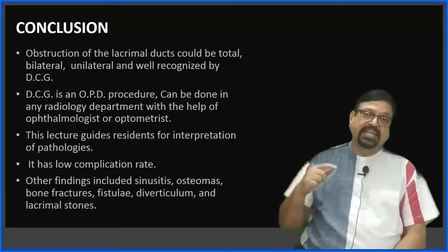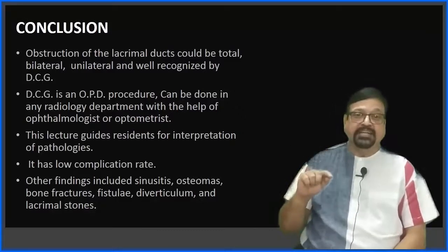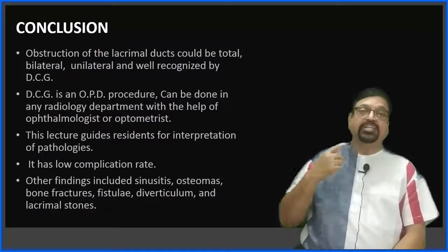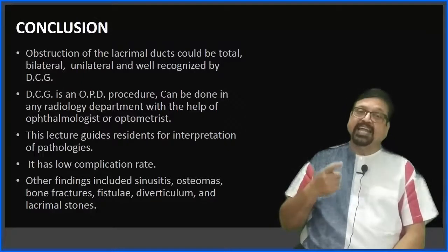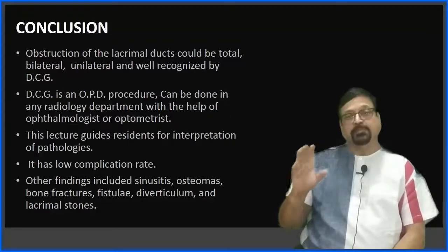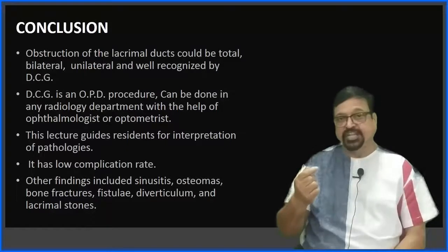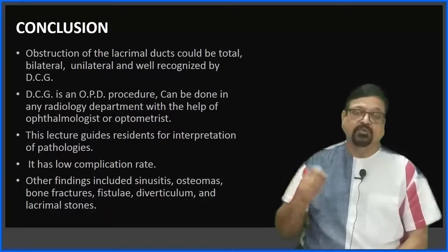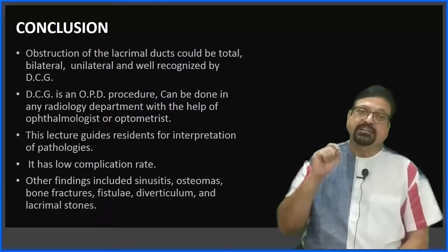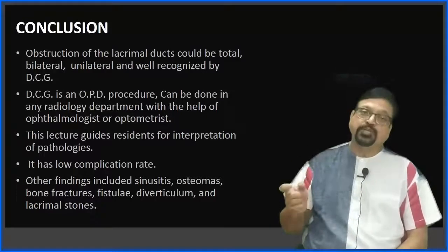Then we have seen how post-procedural care is taken, what care is to be taken during the examination, what the instructions to the patient are, and at the end of all these things, when we see a lacrimal apparatus, how to report it, how a puncta looks, that is through your observation, that will not come on the X-ray. So first you observe the puncta, be sure it is not infected. If it is infected, then you postpone the procedure.